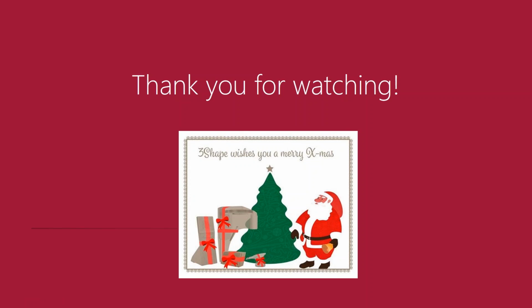Watch out for the announcements on the next series of webinars that will be starting early next year. And one of the things we want to follow up on is this webinar, and taking it into the software and seeing how this plays out in there.